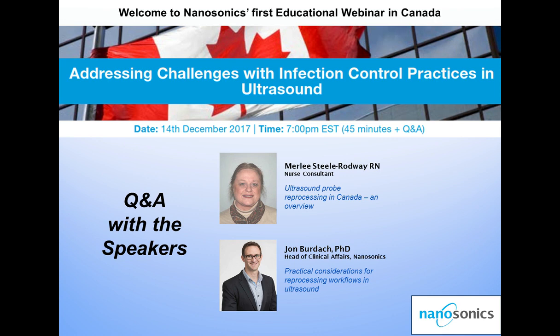I know people purchase them from Walmart stores and different variety stores, but as long as it's big enough for the ultrasound probe and its cable, and you're not coiling it too small, you have to make sure that you're taking care of the equipment itself and that you don't damage it. So it's very important. It's better for you to have it in a container and cover it while walking across the hall than walking with it in your hands, because of the risk of hitting it off a doorway or something like that. And then, of course, you're exposing yourself and others to a contaminated probe.